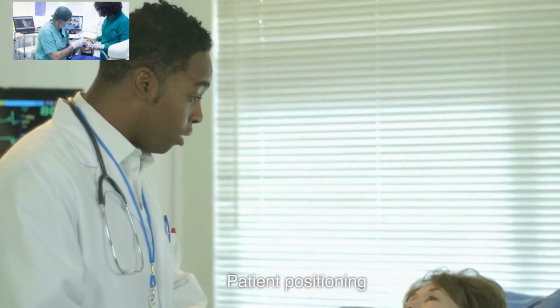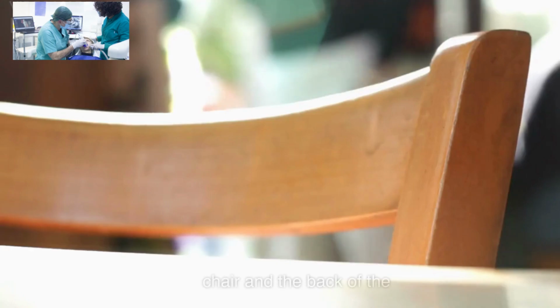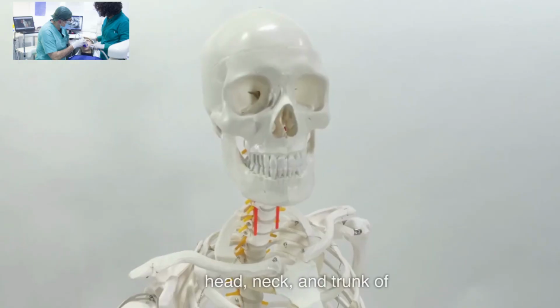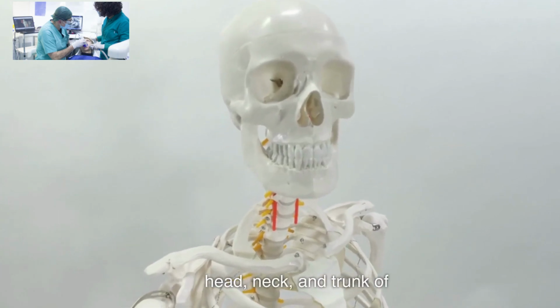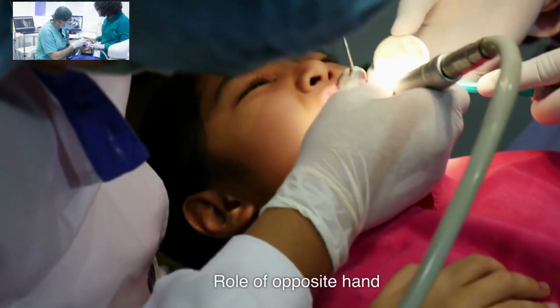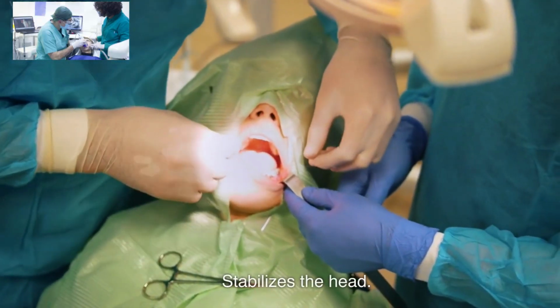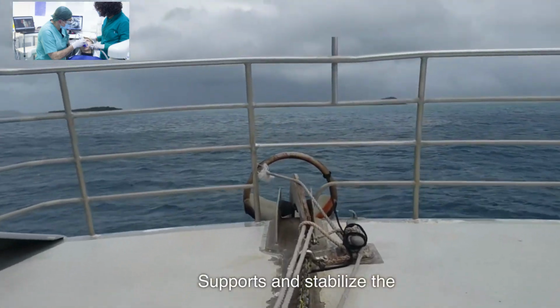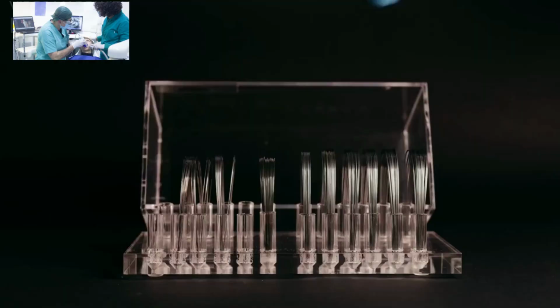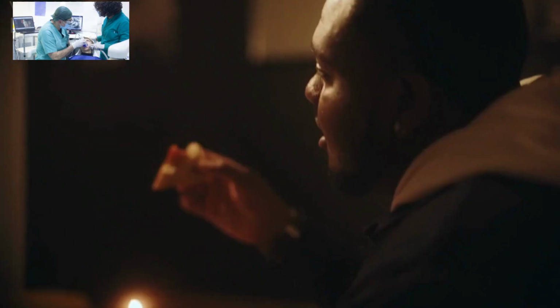Patient positioning. The patient is seated comfortably in the dental chair and the back of the chair adjusted so that the head, neck, and trunk of the patient are in a straight line. Role of the opposite hand: reflect the soft tissues, stabilize the head, support and stabilize the mandible, support the alveolar process. The stability of the teeth in the dental arch depends on 1.